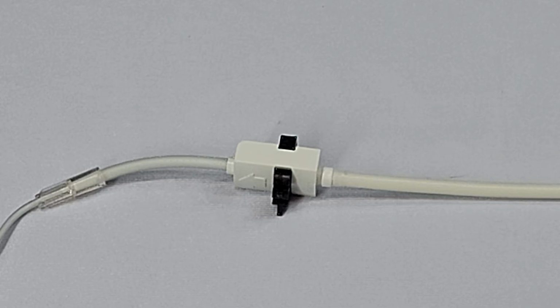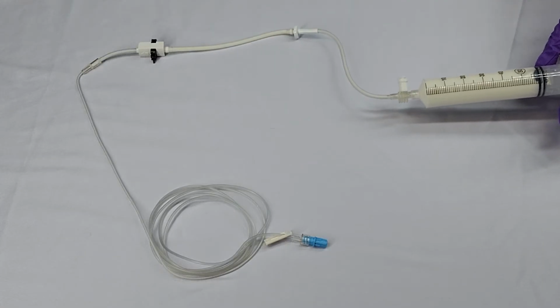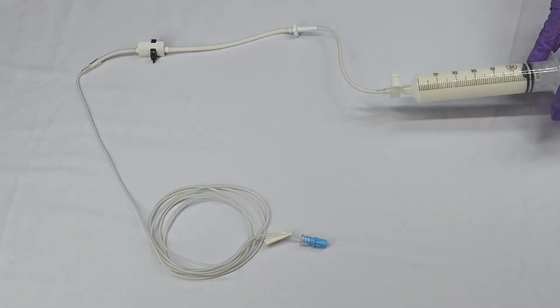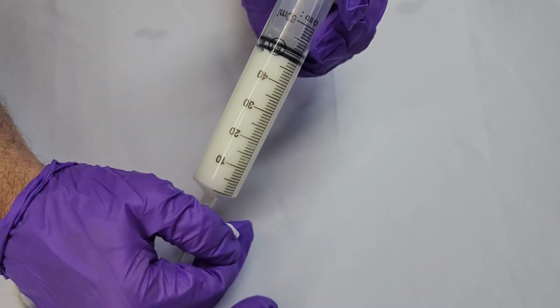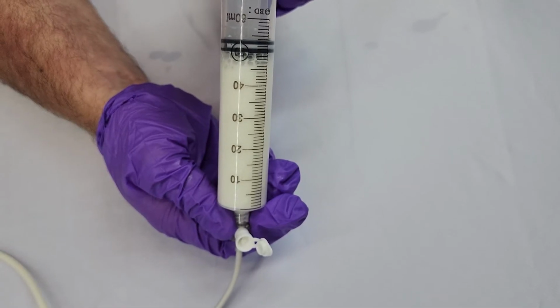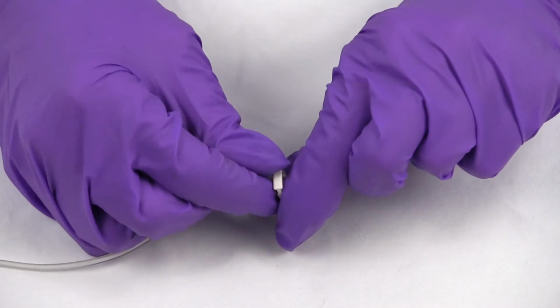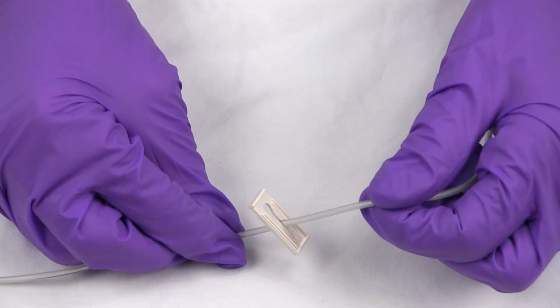Next, the user will verify the black flow preventer clamp is in the open position and the air vent port is capped. The user will then slowly depress the syringe plunger until the entire length of the IV set has been primed. Next, the user will close the black flow preventer clamp and open the air vent port cap. Finally, the user will pull up on the syringe plunger and look for bubbles to appear inside the syringe. As a precautionary measure, it is recommended the white slide clamp on the 1057 syringe set be placed in the closed position until the user is ready to start the infusion.